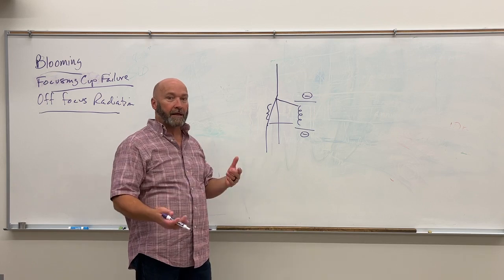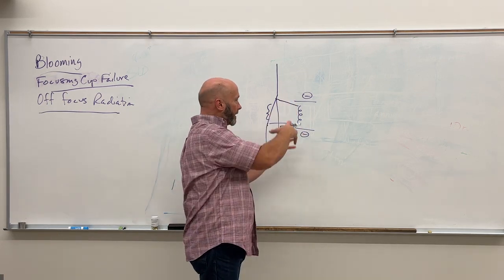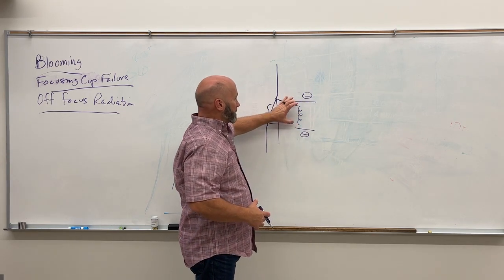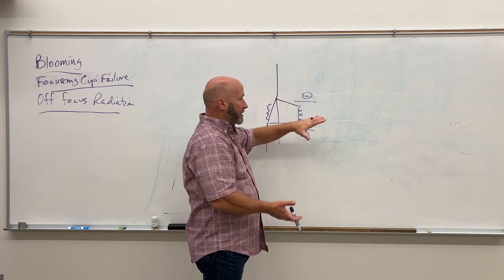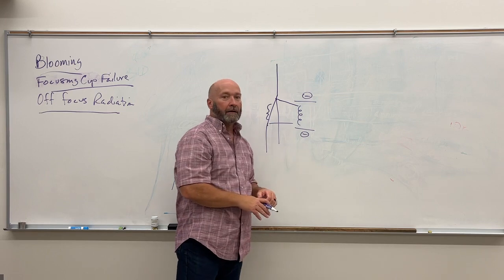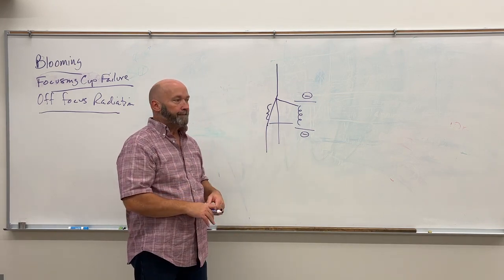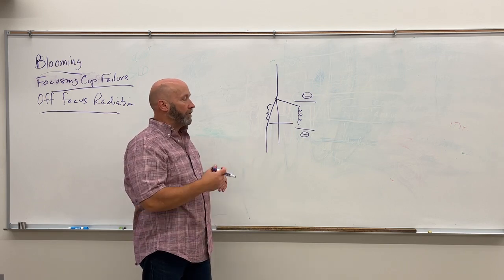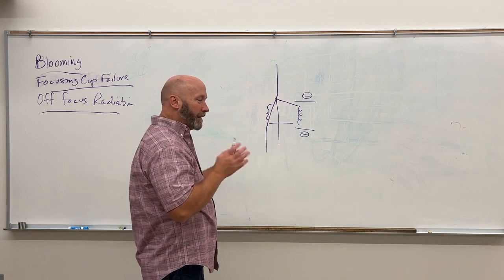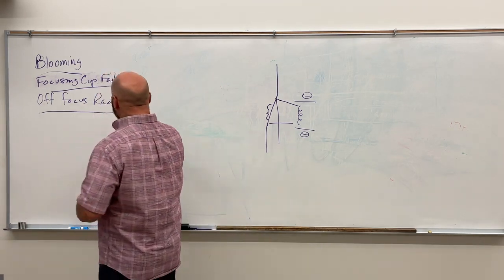So a different reason not to use long prep times would be because you stack so many electrons on your filament that the focusing cup has a difficult time compressing them enough. And so when the KVP comes into play, they spread out and interact on the target in a larger area than what you wanted them to be interacting. So you lose sharpness of recorded detail. All right, so hopefully I've explained that well enough that you can kind of keep the three separated.